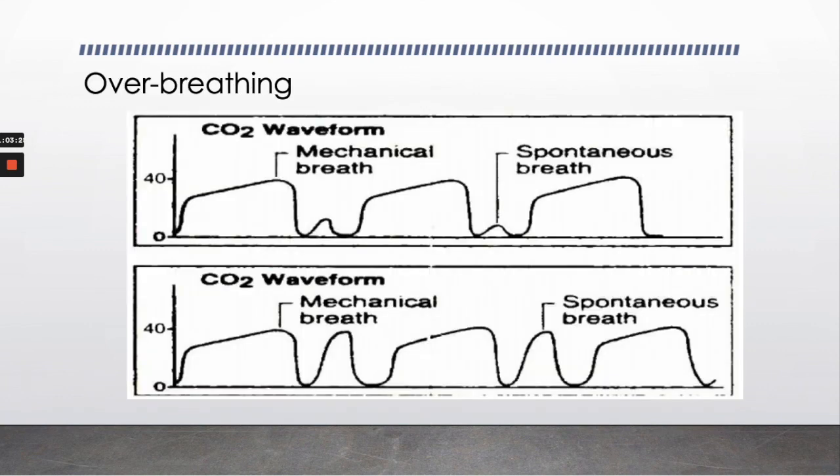Okay, so over breathing the vent. All right, so here we have breaths that are in between our mechanical ventilation, and that's a spontaneous breath. And it's a spontaneous breath, so their muscle relaxant has definitely worn off.